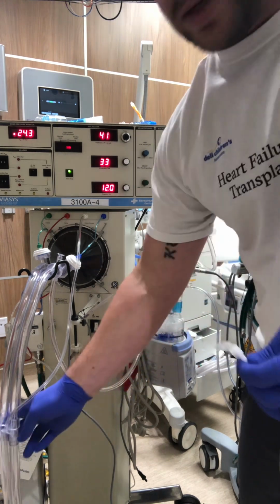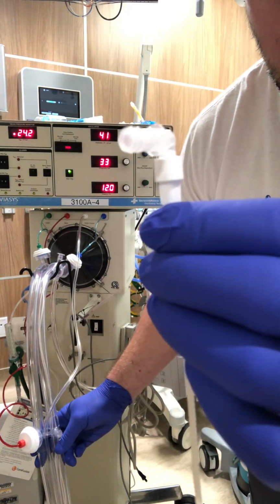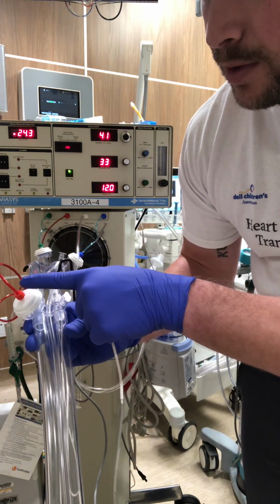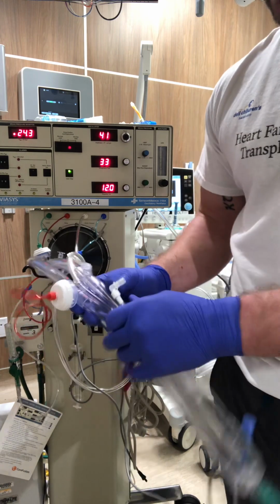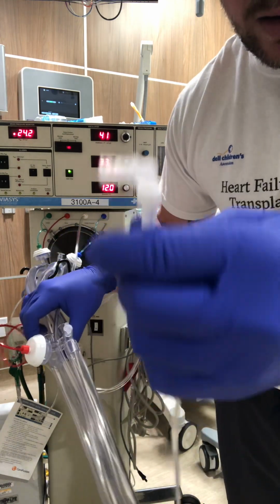Same thing with your sample line. So we talked about we need the nitric sampling elbow that attaches to the port near the red line mushroom cap right here, okay? So there is a cap here currently that we need to pop off so that we can add our elbow to it.